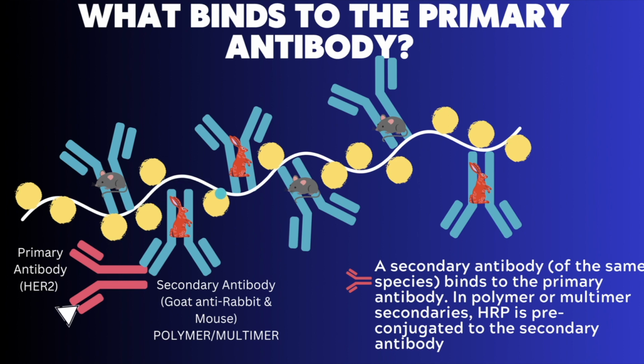Now, if you recall in the previous slide, this HER2 antibody was raised in a rabbit, meaning the rabbit secondary will stick to the HER2 antibody, while the mouse-derived antibody will not. So what ends up happening is this tiny epitope has HER2 attached to it, the rabbit secondary is now stuck to that, and this entire parade float of other molecules are now going along for the ride. In IHC, you can now understand why this series of events is called amplification.